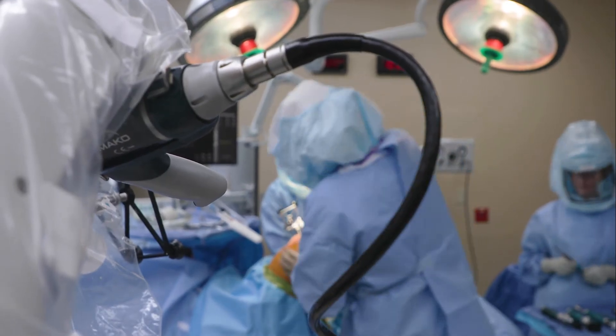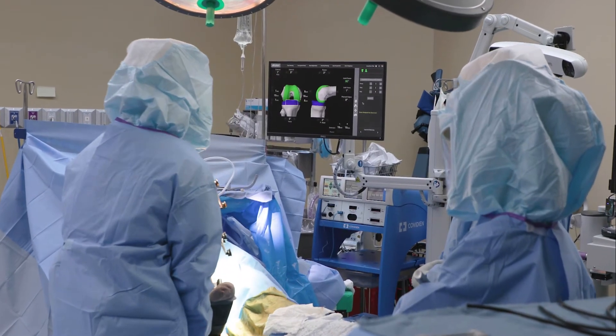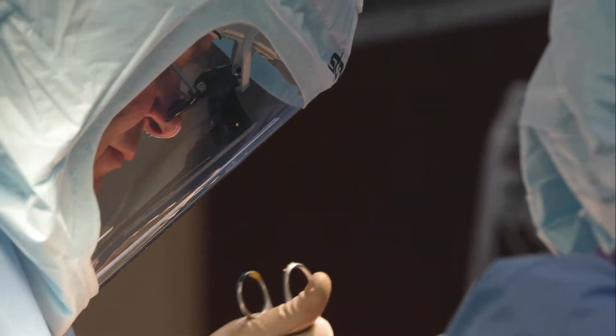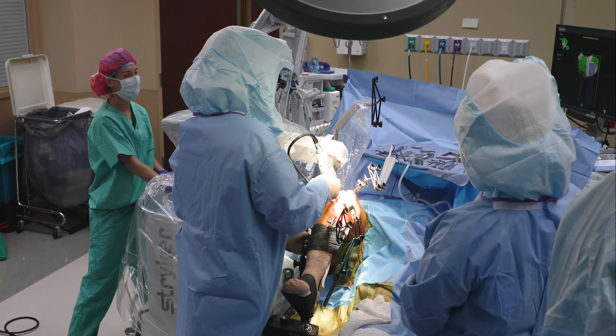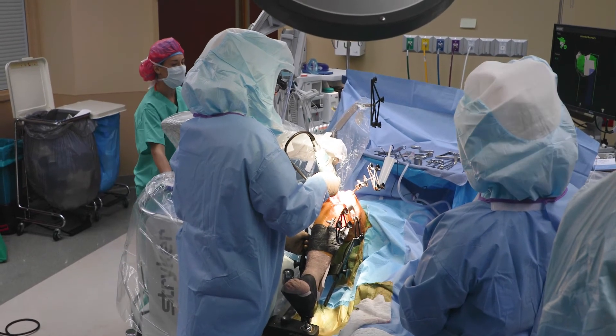I will then bring the saw into the field. It's driven by the robot. It will only allow me to make the cuts that I just told it I wanted to make. I'm using the saw, I'm guiding the saw, making the cuts based on the CT scan.